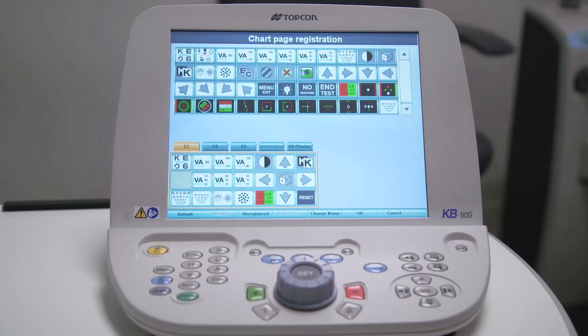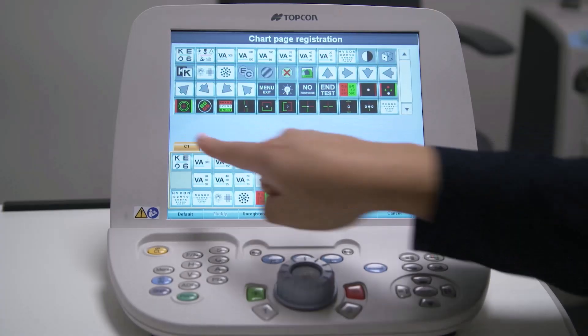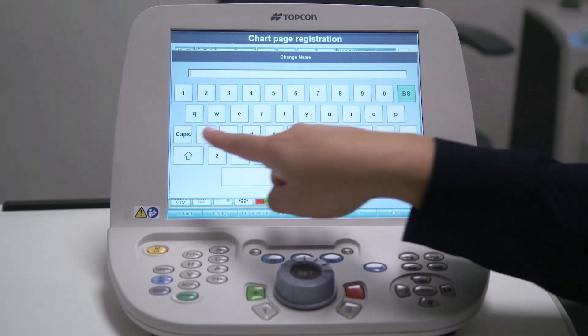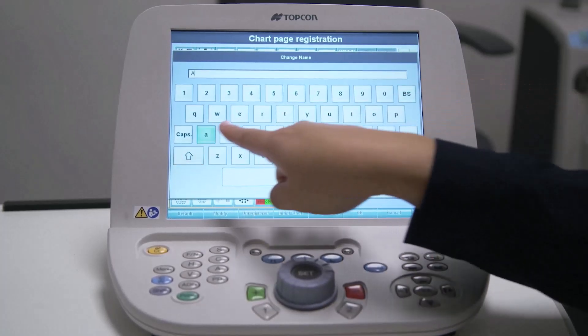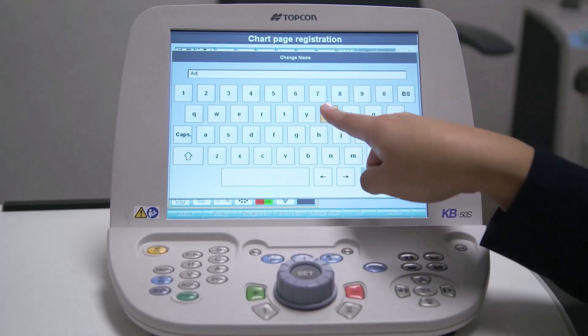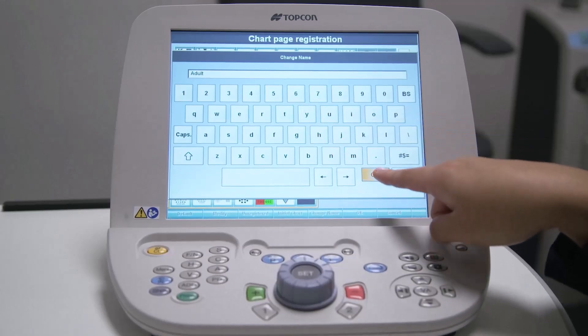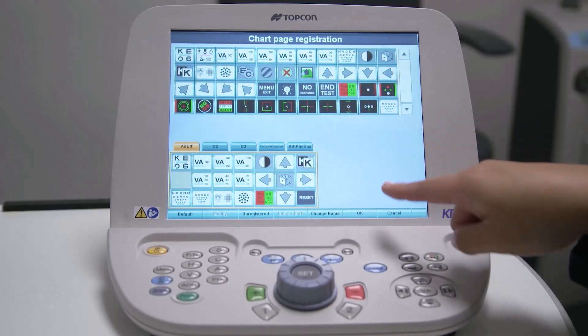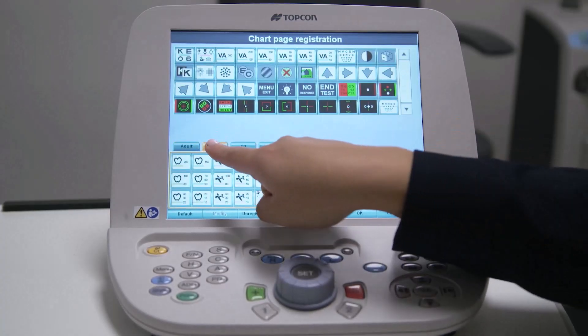Now let's customize these tabs. Select the first tab and select Change Name from the lower menu. This will display a keyboard that allows you to type in a name for the first tab. You can name this tab whatever you want, but for now let's name it 'Adult.' Select OK and repeat this process for each tab.